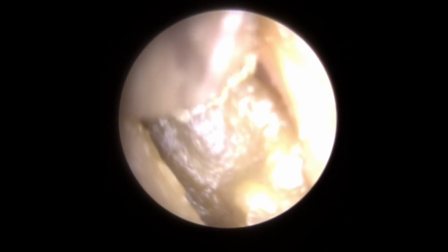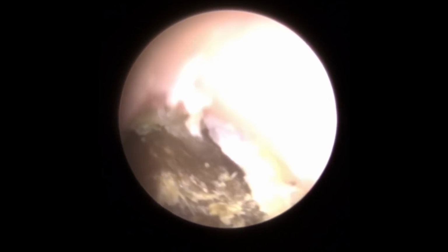We've got a very narrow, long canal. So we've got a very narrow, long piece of wax. Now the Jobson horn can't get in. So the bend on the end of the Jobson horn can't get into the wax. It also can't get behind it because it's too long. So you can see that we're restricted here in the tools that we can use. None of the tools are really getting an effective pull on this wax.